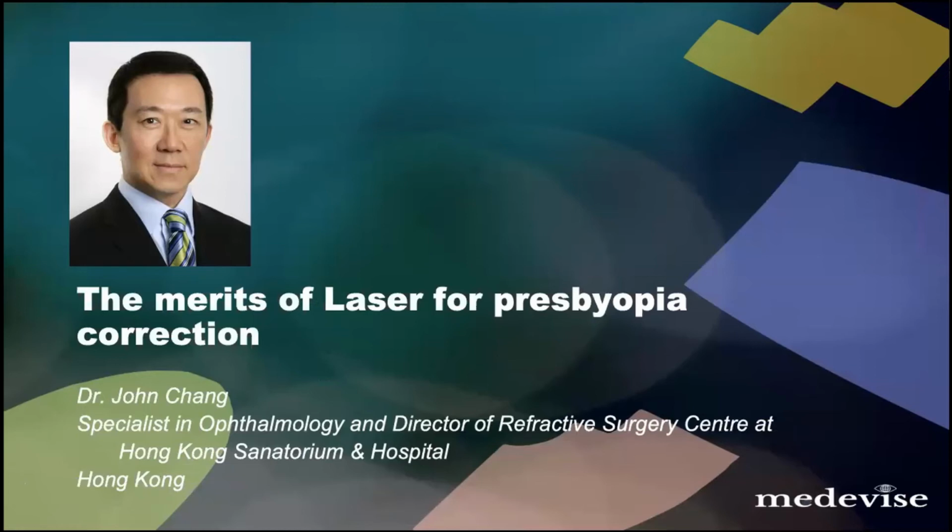And with presbyopia, what is your standard treatment approach? I adjust the spherical aberration. Actually, I use the EX500 to do that. It's kind of like a laser blended vision. So I increase the spherical aberration, or what we call the Q value, especially in the non-dominant eye. As well as some monovision, I increase the spherical aberration for that eye, so it has an increased depth of focus. So for the non-dominant eye, I'm targeting usually about 1.50 diopters.